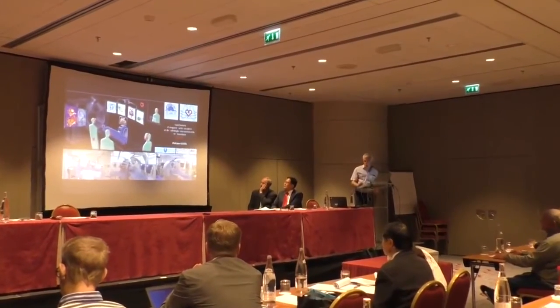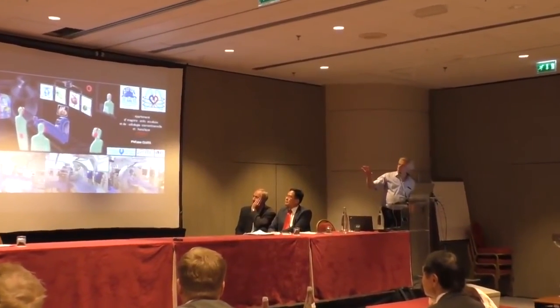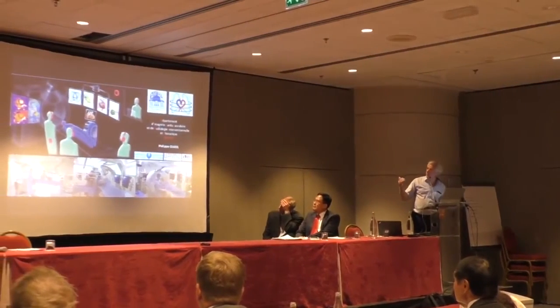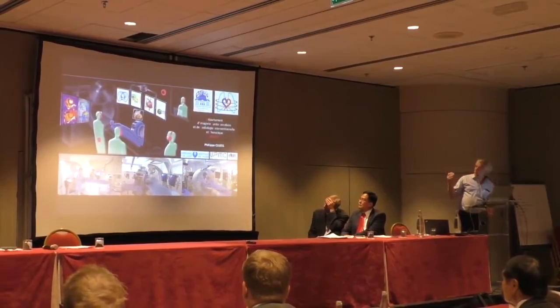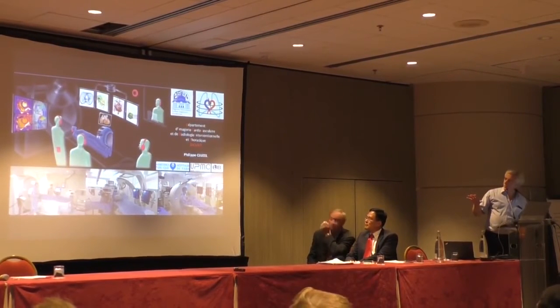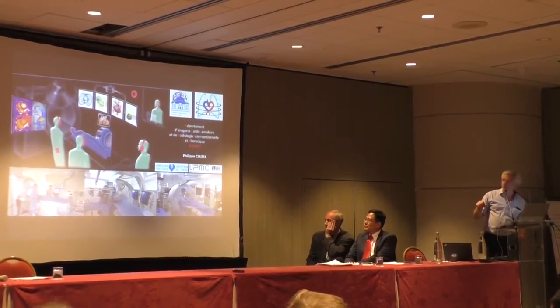And as you can see on the picture, we are doing cardiac imaging under MRI and CT. We are doing interventional radiology with angiography, angioplasty, etc. And we are also doing interventional radiology in cardiovascular, but also in oncology, either under angiography, CT guidance, or MRI guidance.